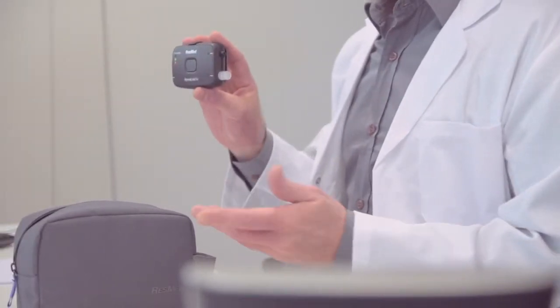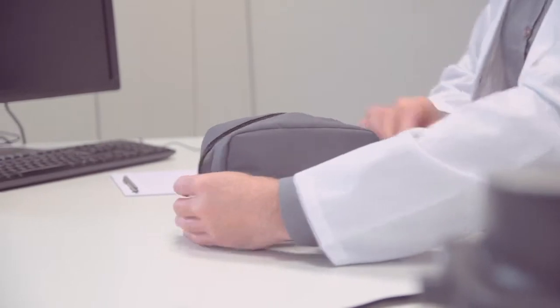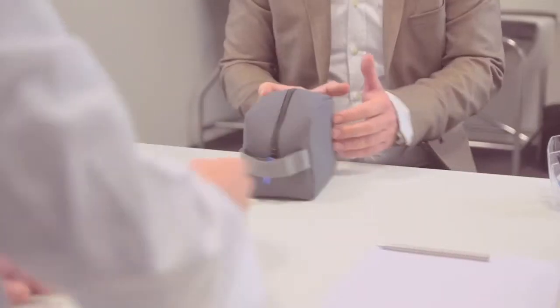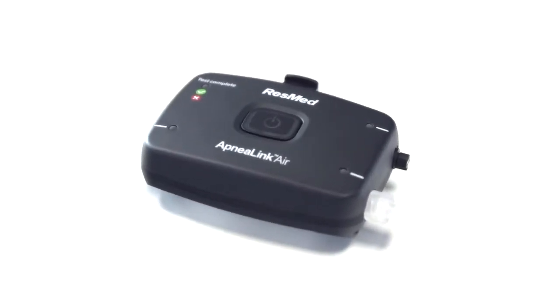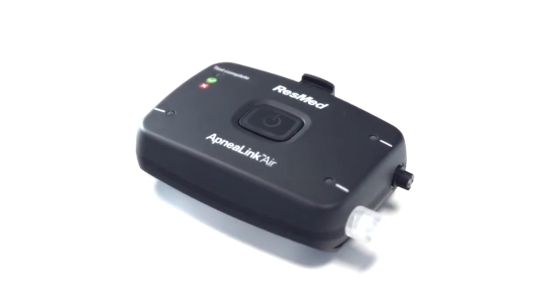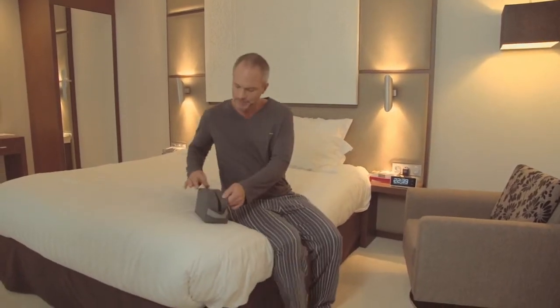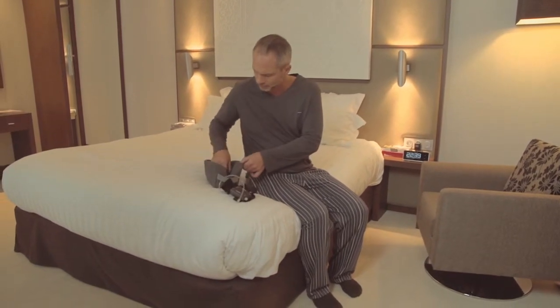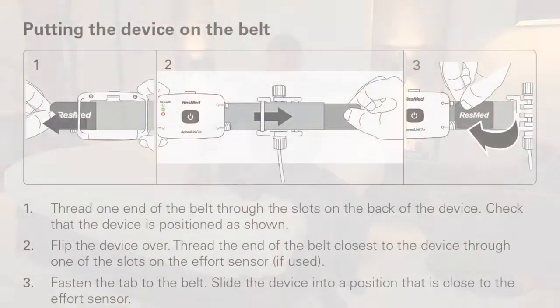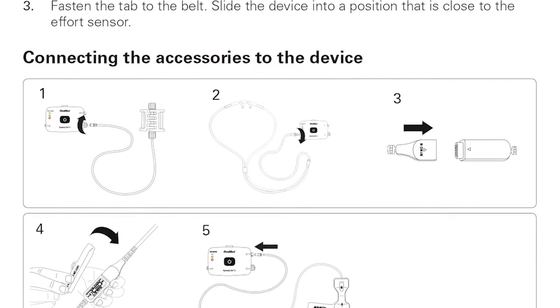Your clinician has recently given you an ApneaLink Air device to get tested for sleep apnea in the comfort of your own bedroom. Don't worry, it's simple and easy to use. ResMed ApneaLink Air is a device which helps to detect sleep apnea in one quick and simple overnight study. This short video will help to familiarise you with ResMed's ApneaLink Air and make sure you use it correctly and efficiently. At any time in the setup you can also refer to the patient instructions provided by your clinician to get further details.